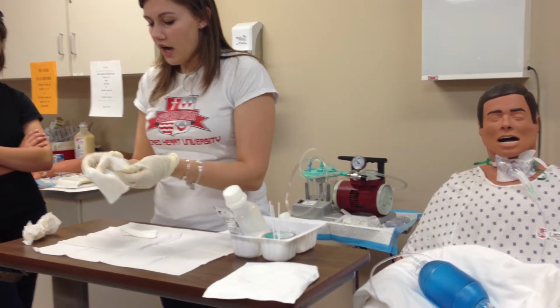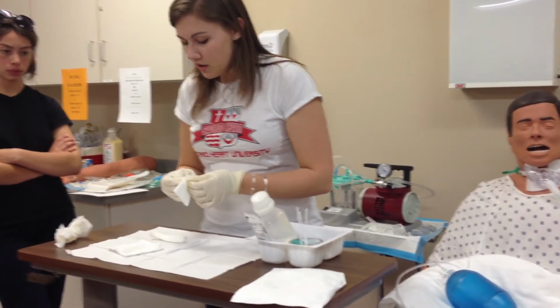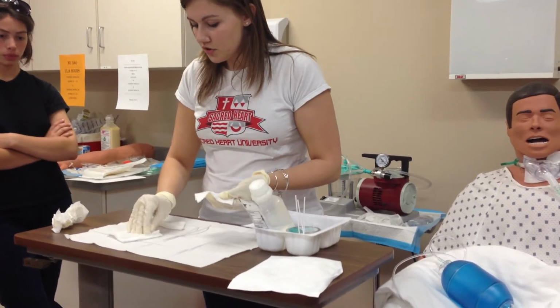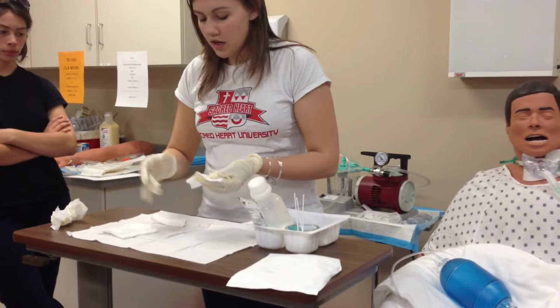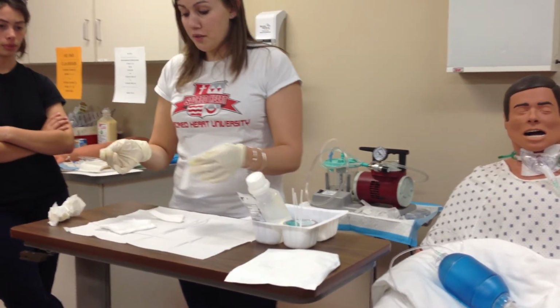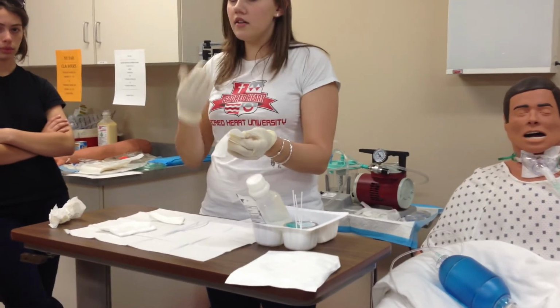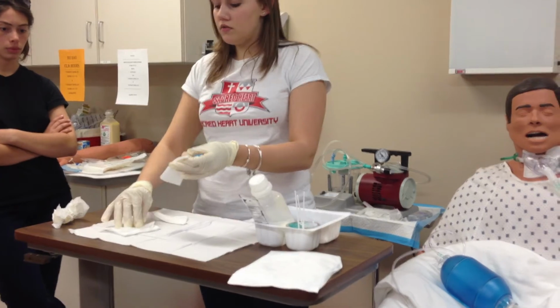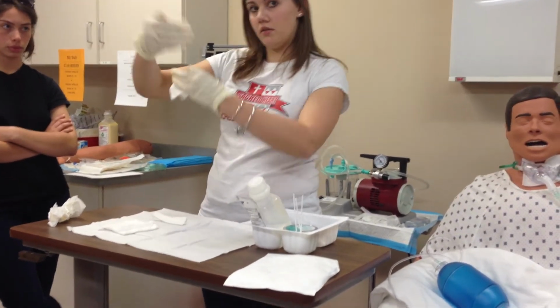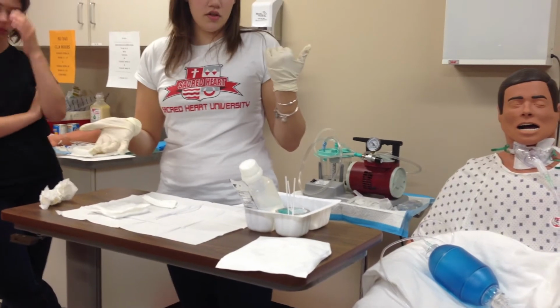And then here you have just the gauze, and there should be one that has a slit in it, which is the one that you put around the trach, which they must have used. If for some reason there isn't one in there, which there should be, you never cut this because the particles can go into their trach. So you would just fold like 2 pieces and just put them on either side. Okay? So now you're ready to start cleaning.